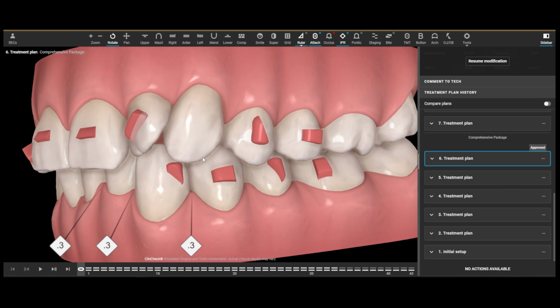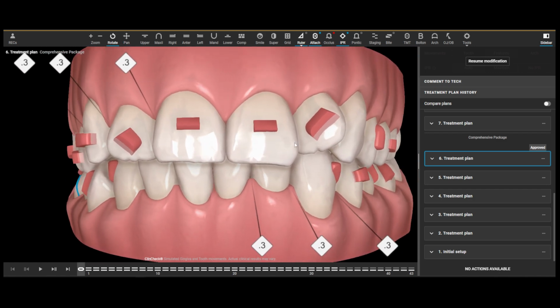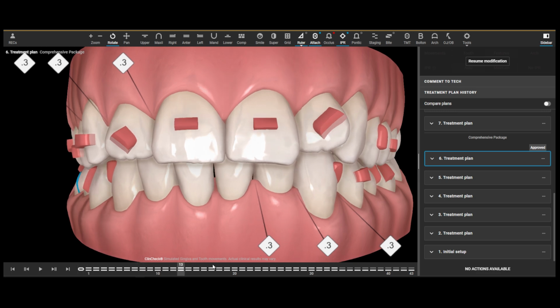And for perspective, I did this case when I was less than 1 year into doing my Invisalign treatment. This was 2018, August 1st. So I had done less than like 200 cases at this point. This was one of my first cases. And so I just want you to see that you shouldn't get paralysis by analysis. You can do things that are not going to be right and it's still fine. Okay, so there's the sash attachment on the lateral to help rotate that tooth.